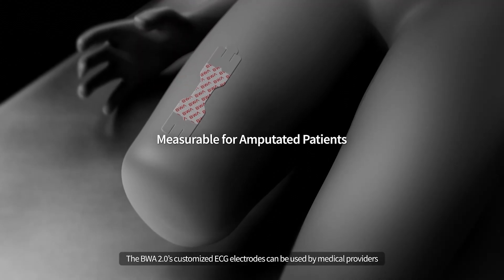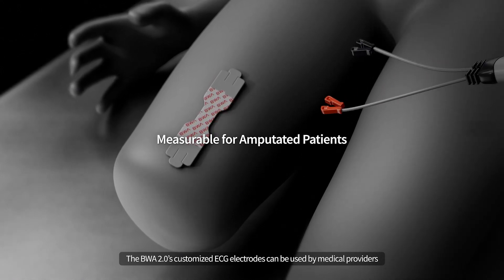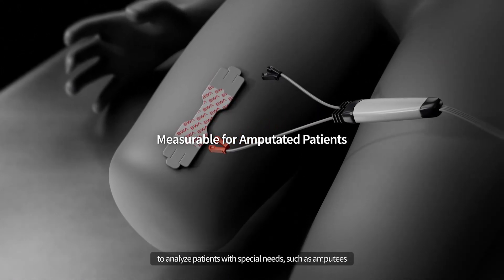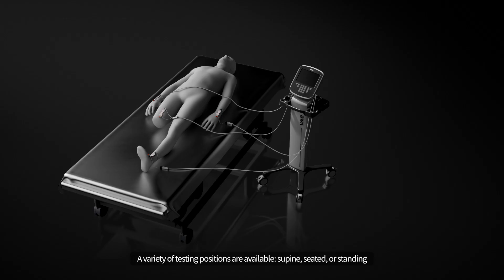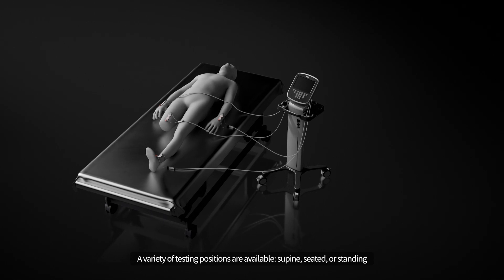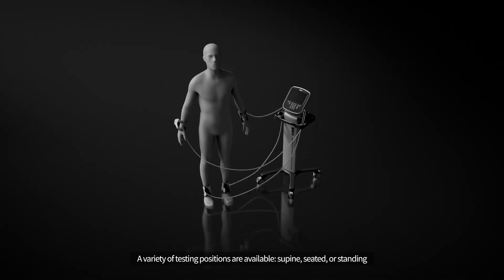The BWA 2.0's customized ECG electrodes can be used by medical providers to analyze patients with special needs, such as amputees. A variety of testing positions are available: supine, seated, or standing.